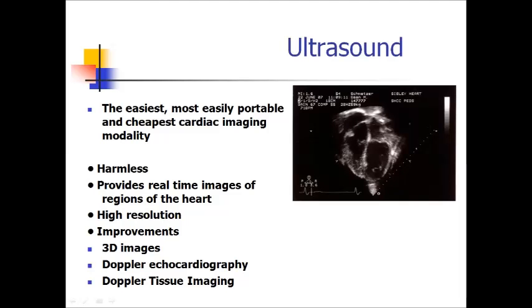Ultrasound is the easiest, portable, and cheapest cardiac imaging modality. It's harmless, and provides real-time imaging of different regions of the heart. It has high resolution and possible improvements, for example, three-dimensional reconstruction or addition of Doppler function for echocardiography.